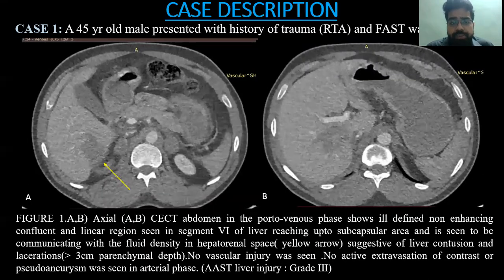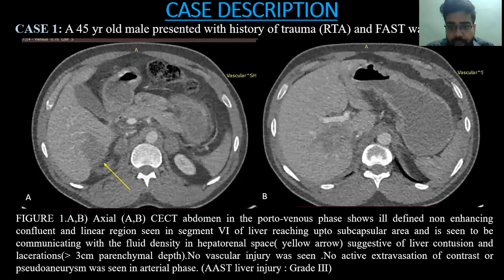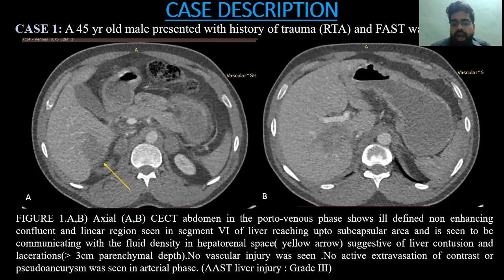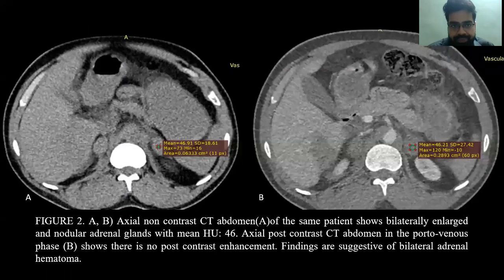Case 1: A 45-year-old male presented with history of trauma and was FAST-positive. Axial scans of CECT abdomen in the portal venous phase show an ill-defined non-enhancing confluent and linear region seen in segment 6 of the liver, reaching up to the sub-capsular area and communicating with fluid density in the hepatorenal space. This represents liver contusion and laceration. No vascular injury was seen. This was graded as AAST liver injury grade 3.